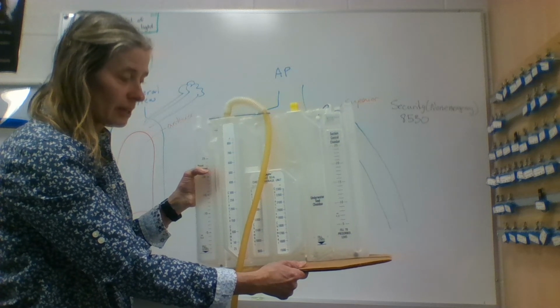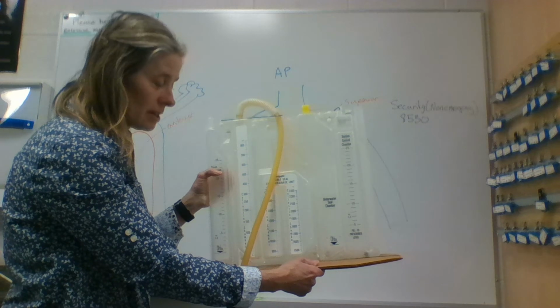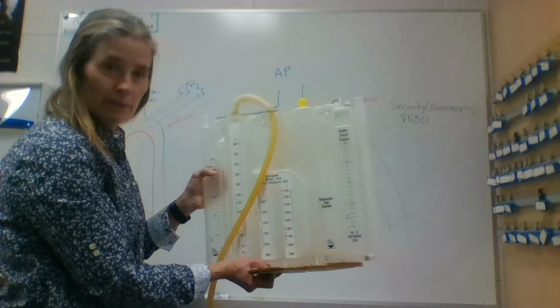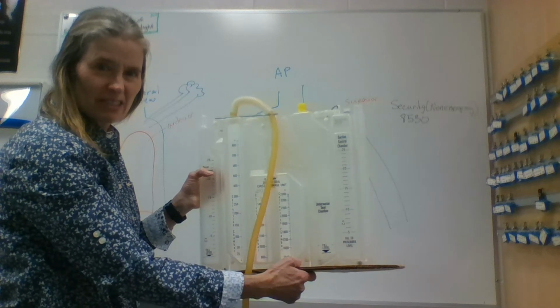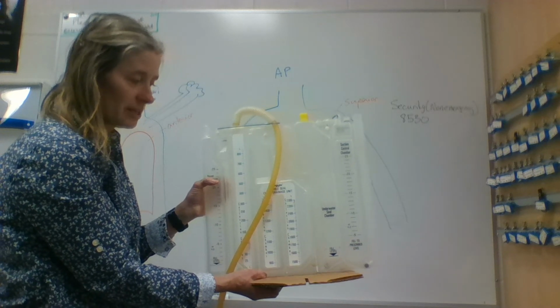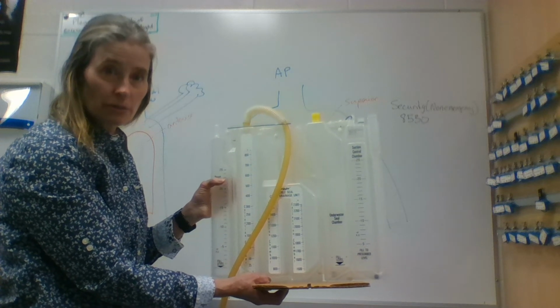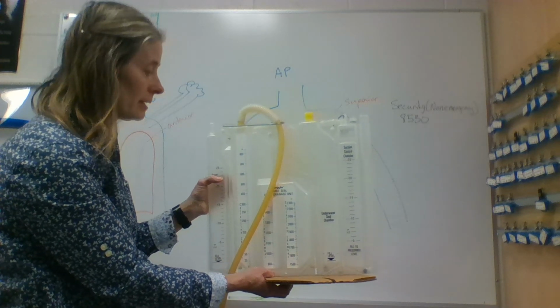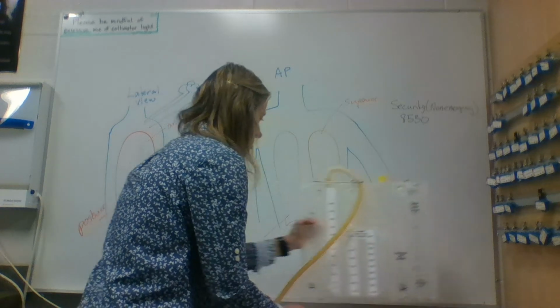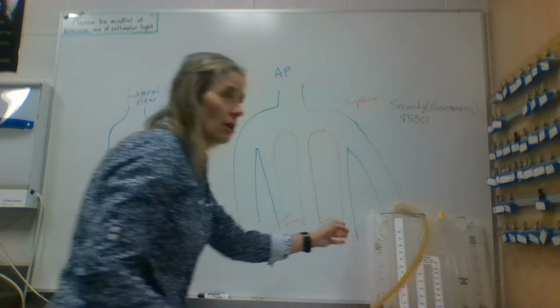If it comes without the feet out, that's because you don't want to break or crack the feet, so you'll have to remove the feet and place them so that it can be safely stabilized on the floor.